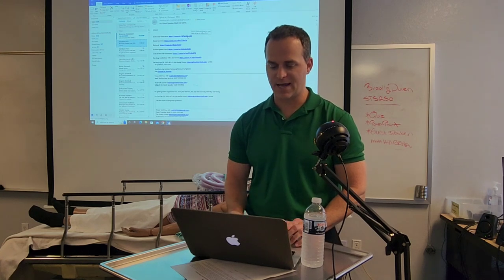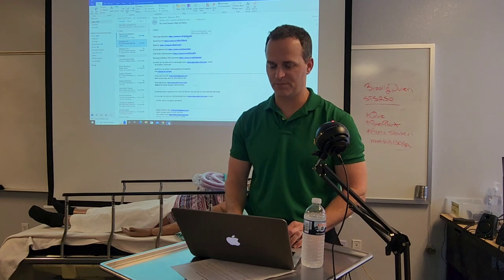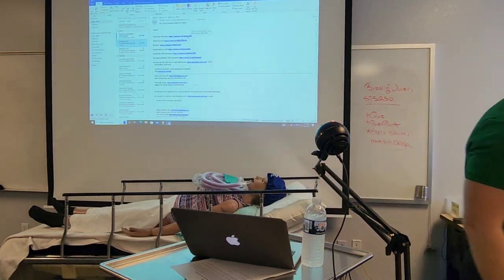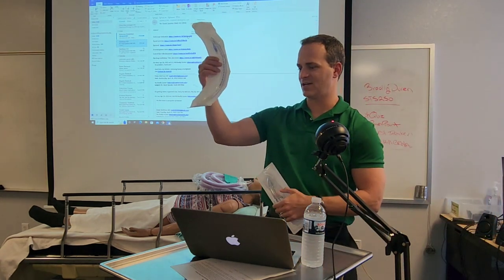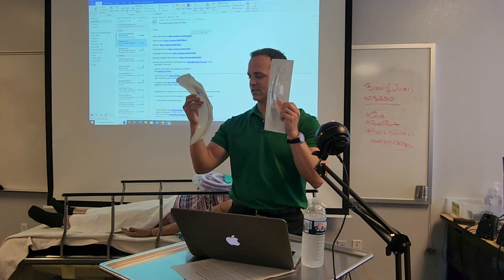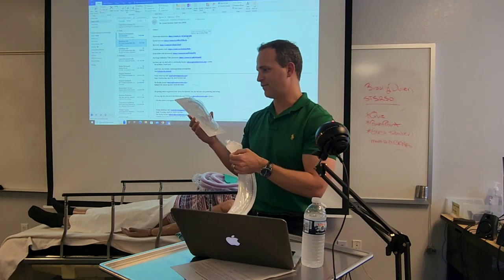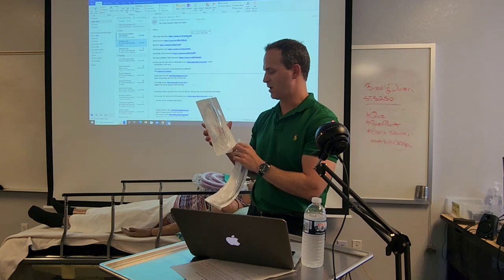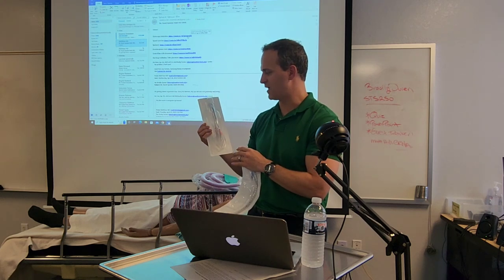So how is anesthetic gas delivered? It's delivered through a face mask that goes on your face. It's connected to tubing that goes through our anesthesia machine. A breathing tube that sits just past the vocal cords in the trachea, or what's called an LMA. This is a laryngeal mask airway. This is a little bit quicker to place than a breathing tube, obviously. But the LMA can be used for emergency airway management if placing a breathing tube is very difficult. Or you can also deliver your anesthetic gas through this and keep your patient safe under anesthesia.